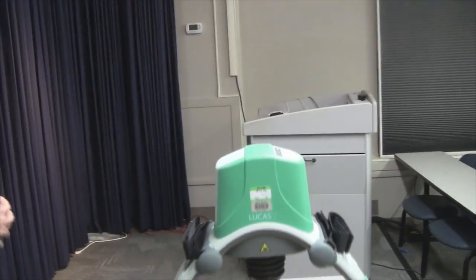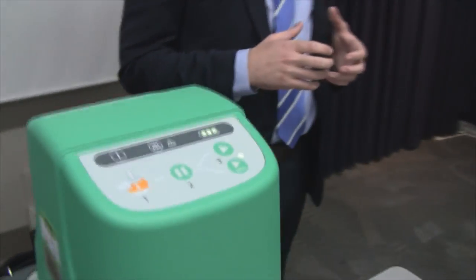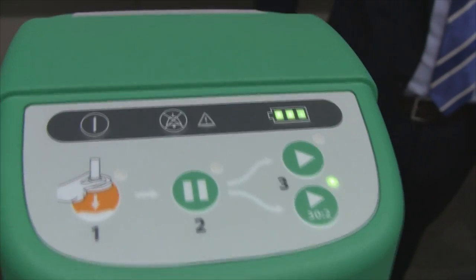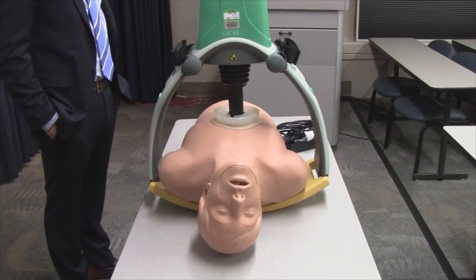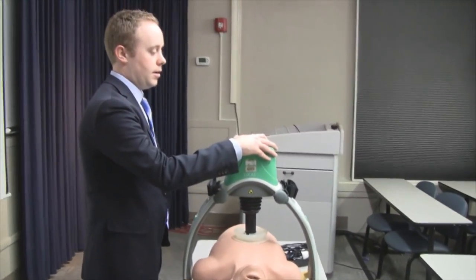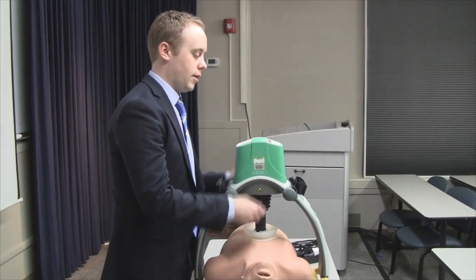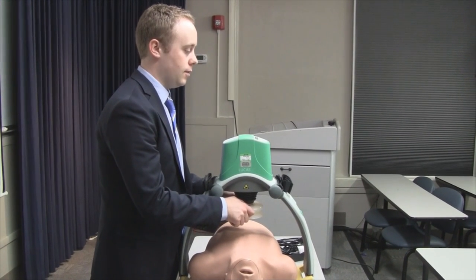By hitting that button it'll count out 30 compressions, a light will come on, you'll hear a tone, and then it'll pause just long enough for two breaths before starting back up automatically. If you need to pause for any reason, hit the pause button. If you need to raise and lower, you can go back to the one position and press that. If it needs to be adjusted after defibrillation, you can do so.